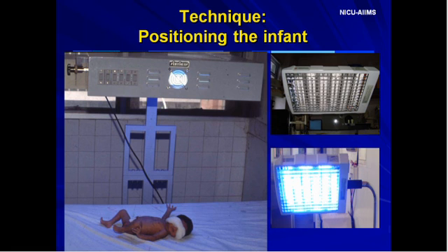If increased irradiance is required, as already mentioned, add a second unit or use double surface or place a fiber optic pad under the infant. We shall discuss the other important points to be taken care of in the subsequent slides.